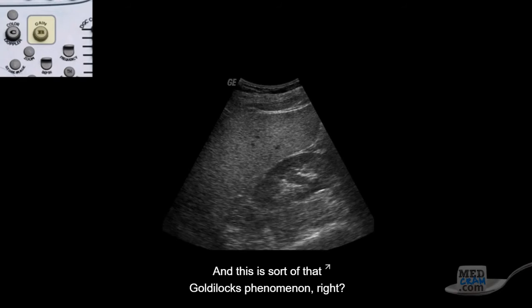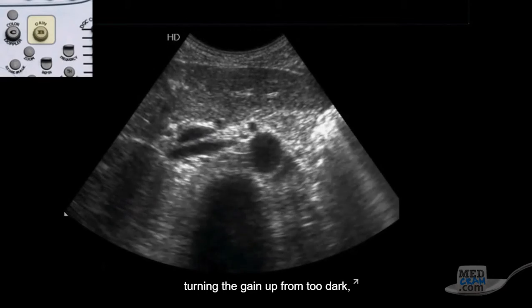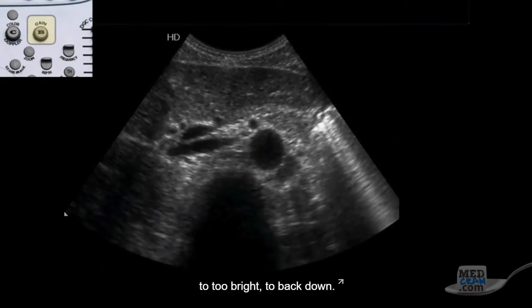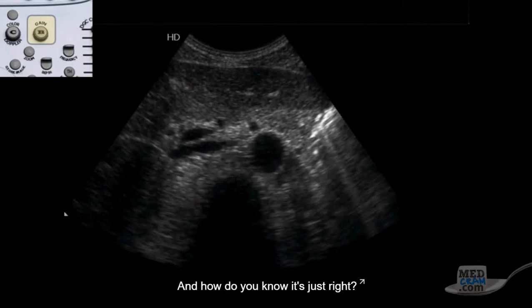And this is sort of that Goldilocks phenomenon, right? It's not too hot, it's not too cold, it's just right. So in this video, here's an example of turning the gain up from too dark to too bright to back down. Now it's just right. And how do you know it's just right?